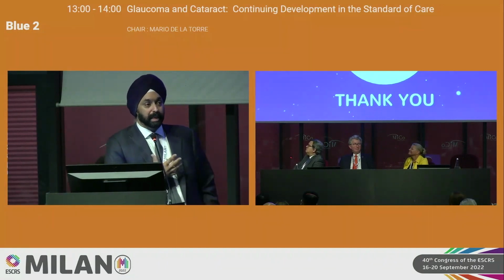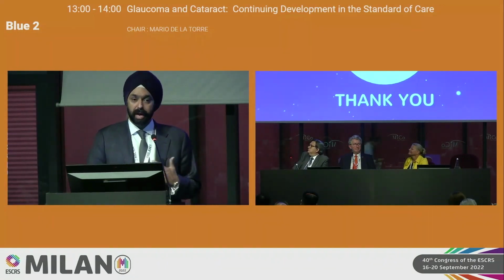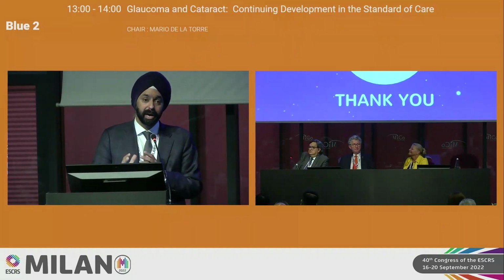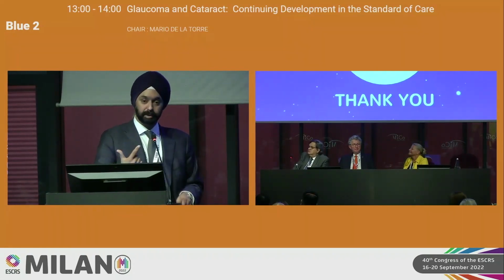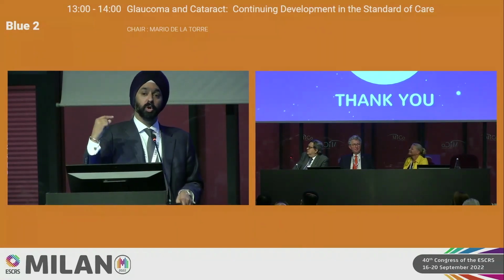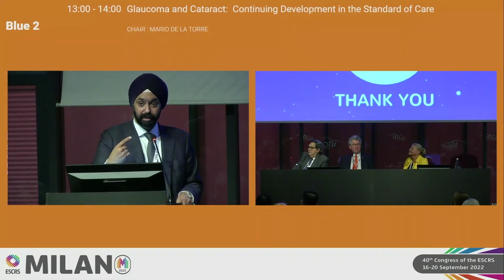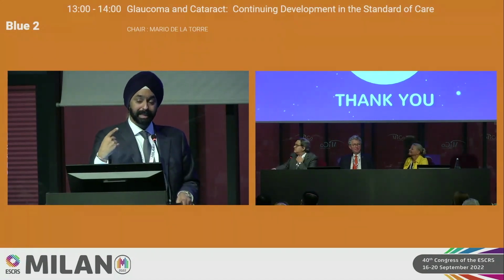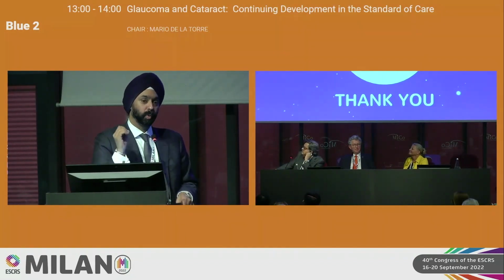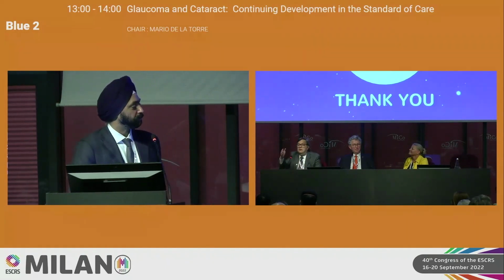And so to me, the fear of ALT versus SLT, I do agree, ALT does cause destruction, but SLT does not. I have done a number of canaloplasty procedures after SLT. In fact, what I wanted to get to, and I didn't have time, was I have a data set out there we're working on getting published where we had failed SLT, did canaloplasty, then did SLT afterwards and found a significant effect. So to me, I think SLT is a great diagnostic tool to tell us where the resistance to outflow is. You have a question, please?